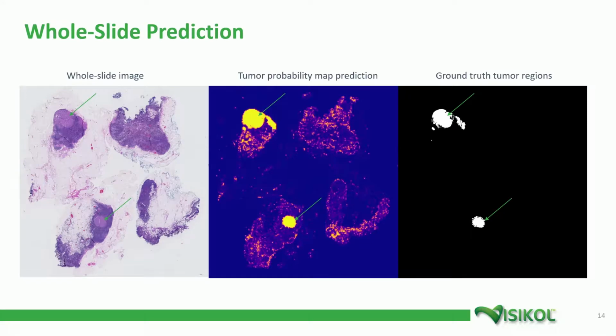Now we are finally ready to test our trained network for whole slide prediction. Our network expects small image patches 96 pixels wide by 96 pixels high as input. Therefore, we break up the whole slide image into many small image patches and classify them using our trained neural network. Then we reorganize the predictions into the same shape as our original whole slide image to visualize our results.